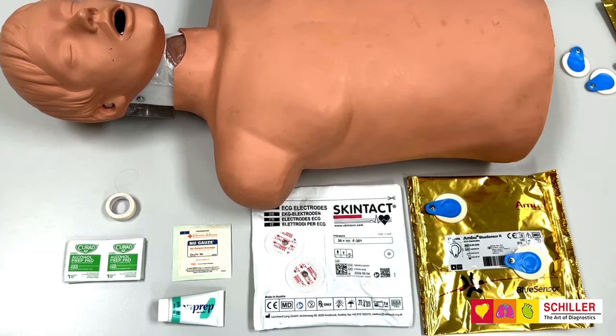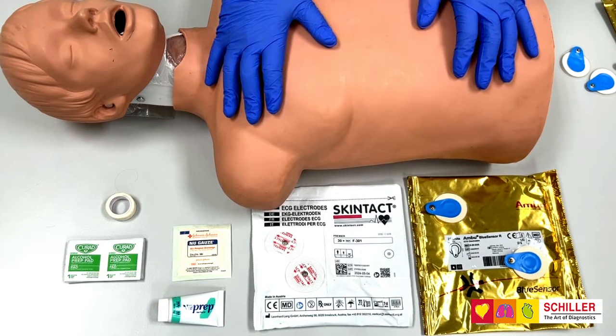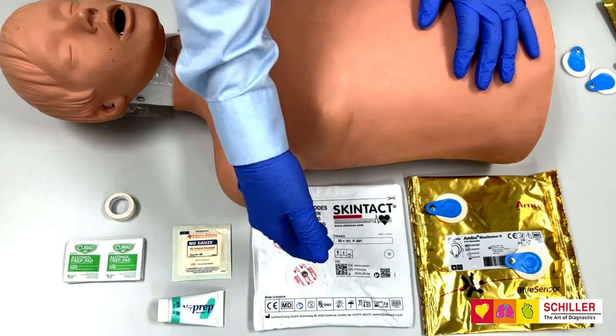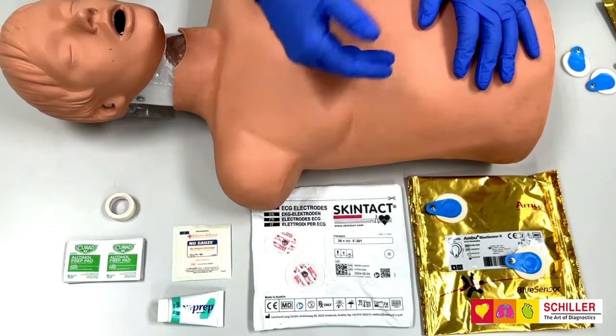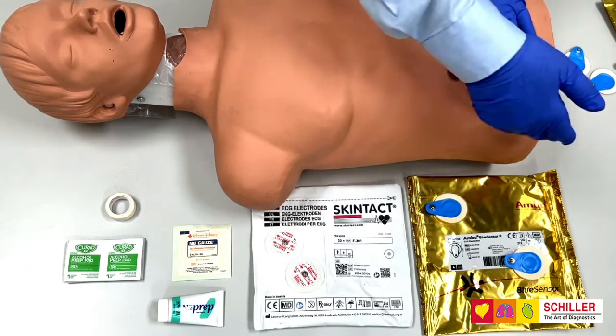Medilog AR Holter Recorder Skin Preparation and Electrode Placement. To prepare the skin correctly for the Medilog AR Holter, you need to have electrodes for stress test and Holter. We recommend Skintact or Ambu.